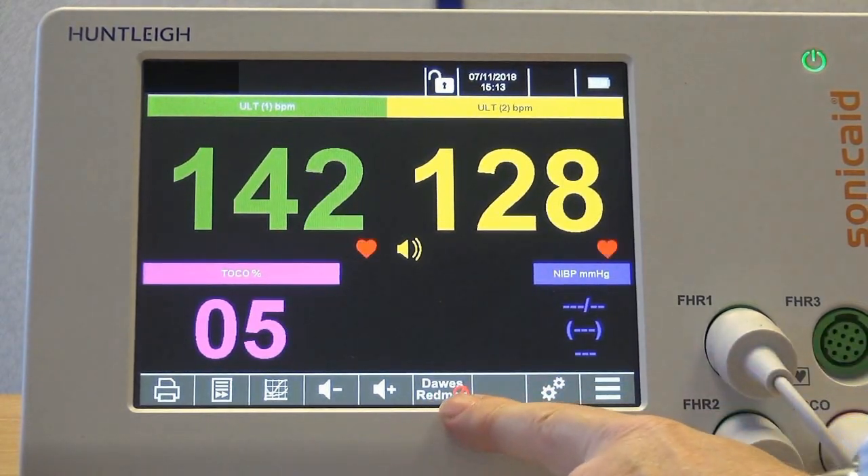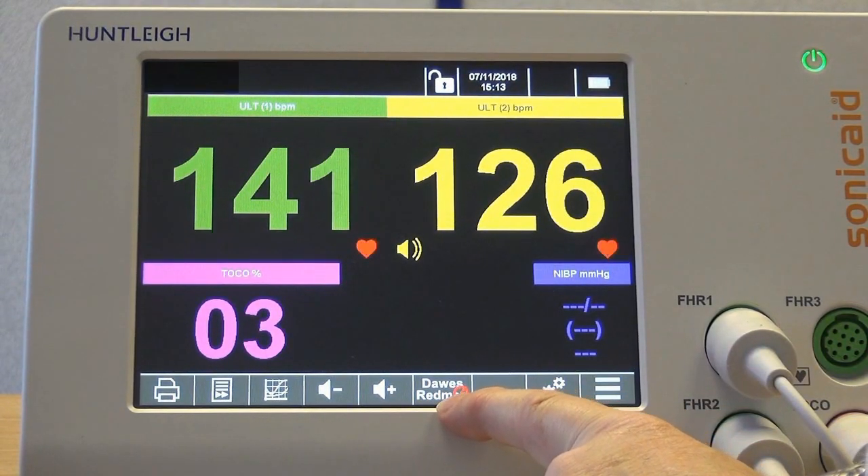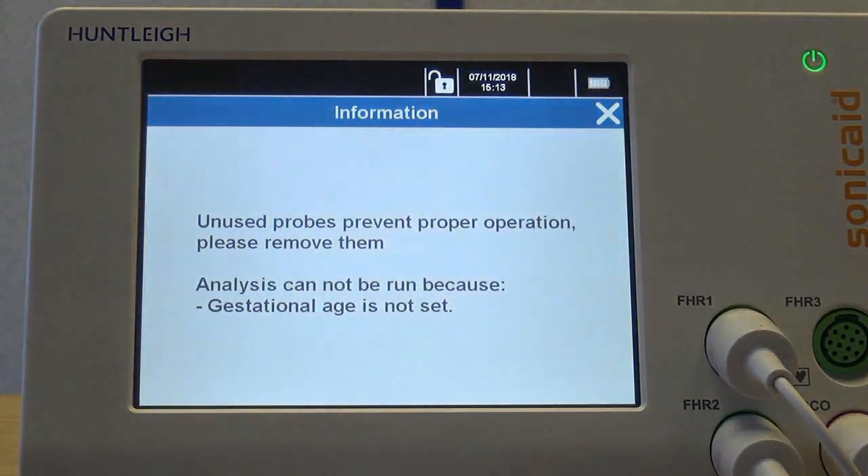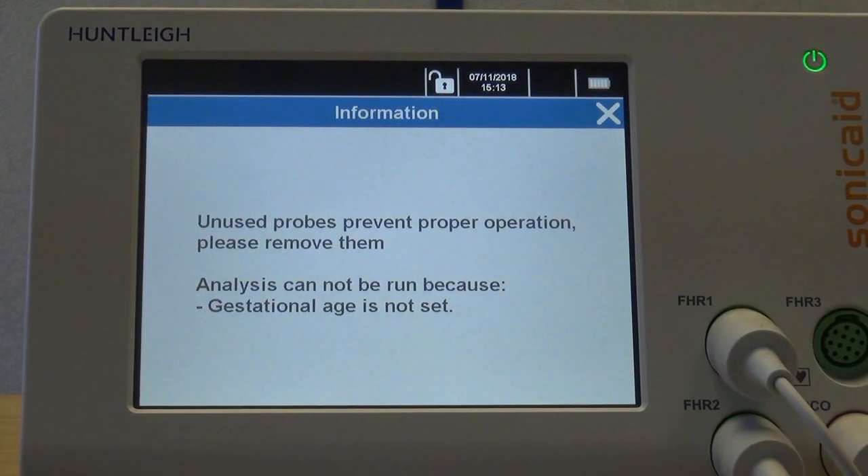The Dawes-Redman CTG analysis button is also present. If unavailable, you will be alerted as to why. In this case, we need to set the gestational age of the patient. Note the warning that if unused probes are left plugged in — for example, a second ultrasound transducer when monitoring a singleton pregnancy — this will affect the analysis.